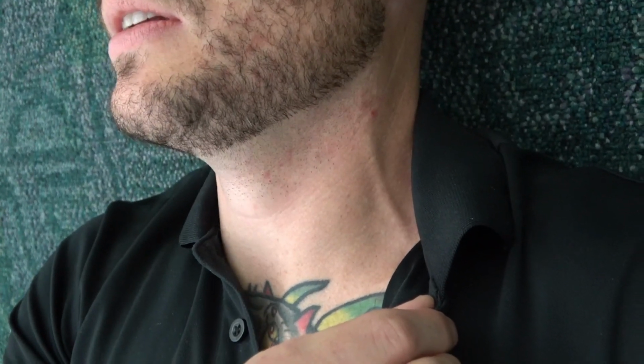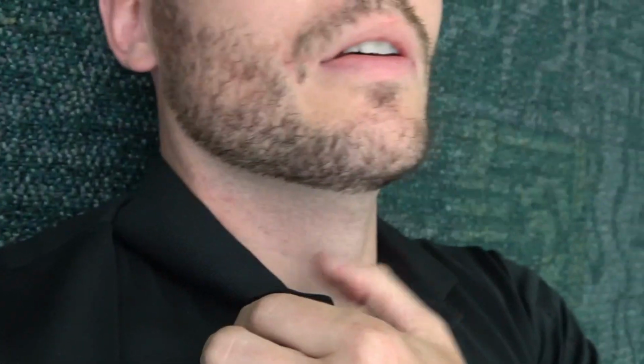Now, I want you to go vein shopping. You're likely going to see EJs on both sides, but I want you to look at both sides because one is probably going to be more prominent and easier to access than the other, all right? So I am not even bearing down, and you can see this EJ site pretty easily, all right? And this is on my left. And let's go ahead and move it over to my right.